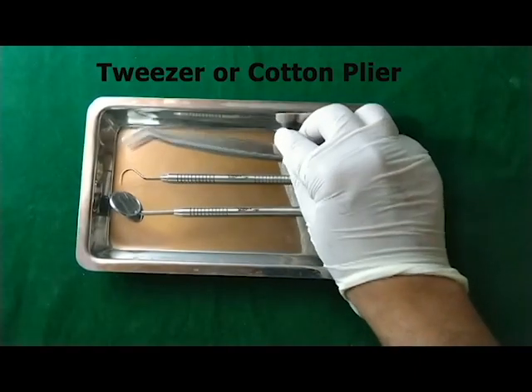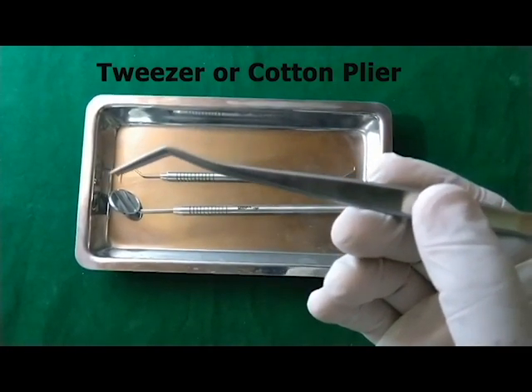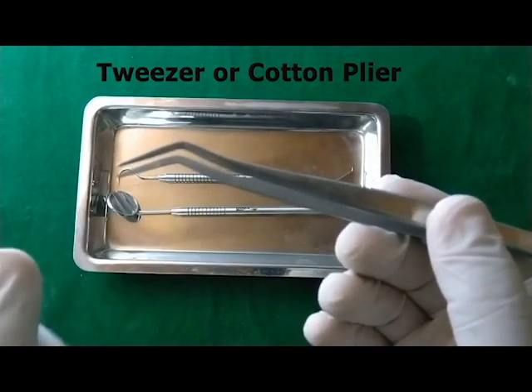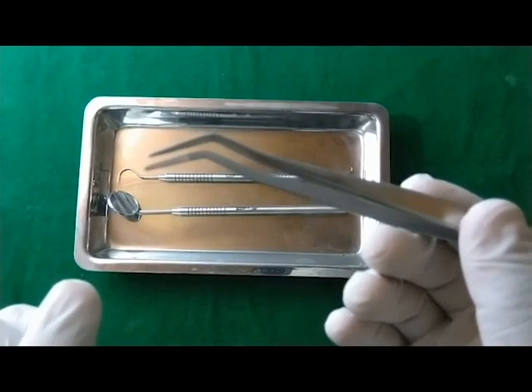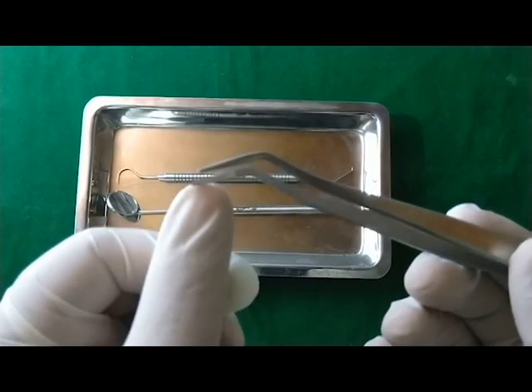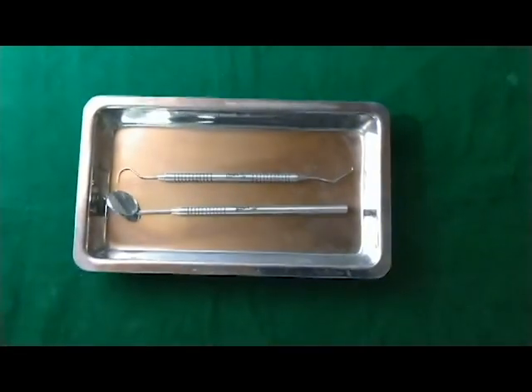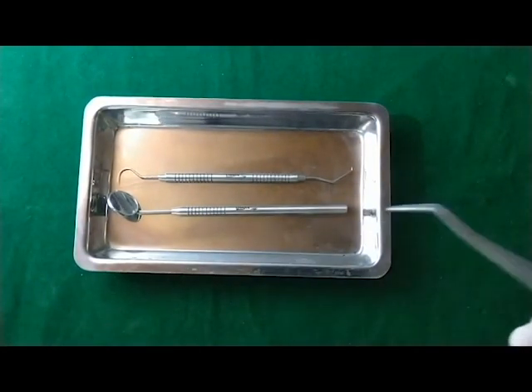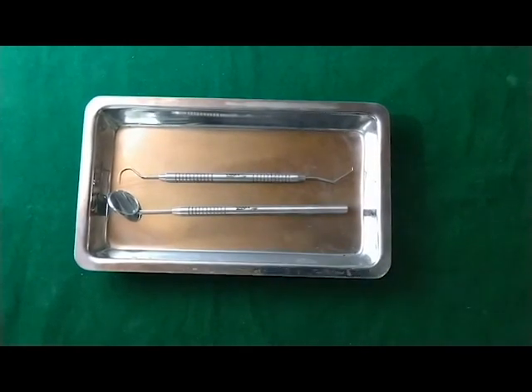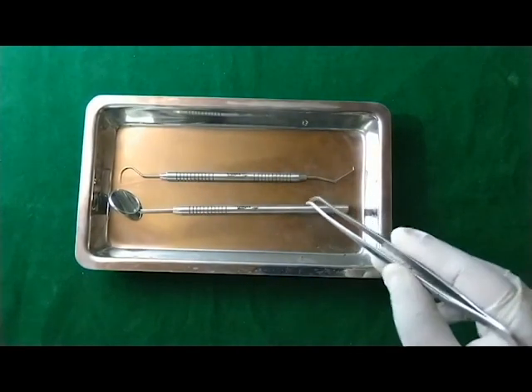The third instrument is the tweezers, also known as the cotton plier. In this tweezers, you can see the beaks are serrated. These tweezers are used for the placement or removal of cotton rolls, wedges, or small instruments, and they can be easily used either within the oral cavity or to pick items from the examination tray.